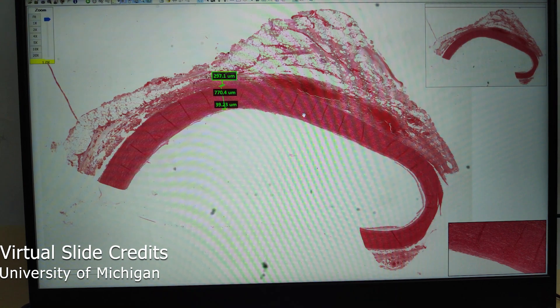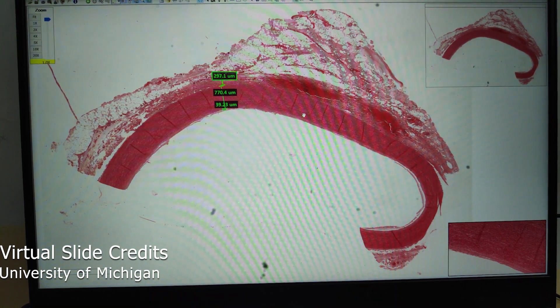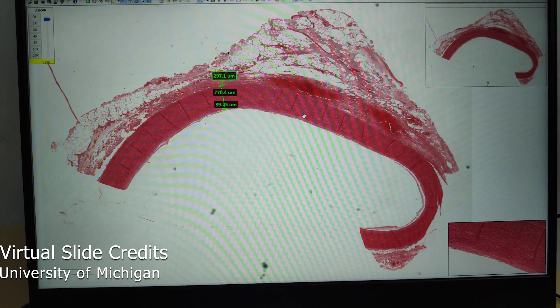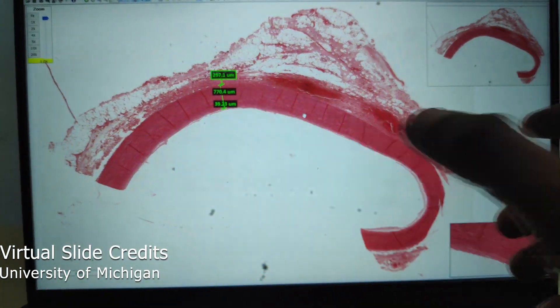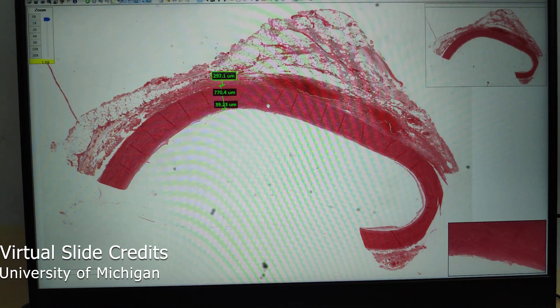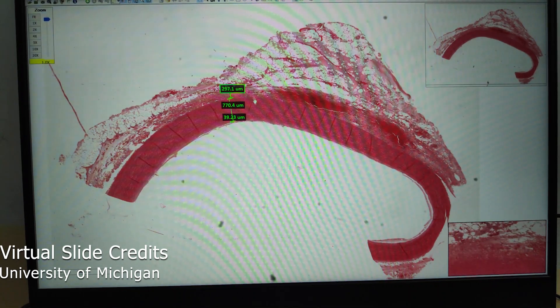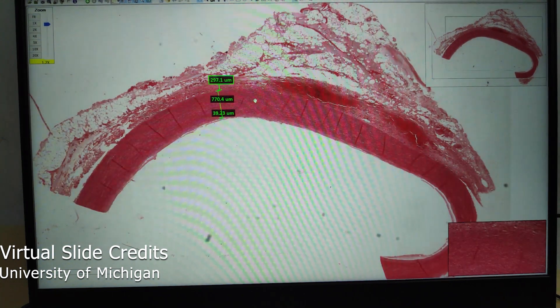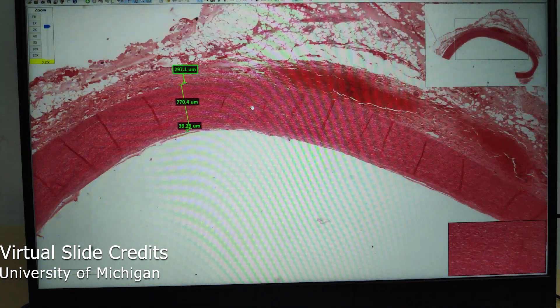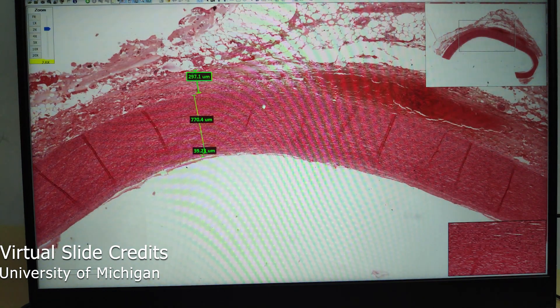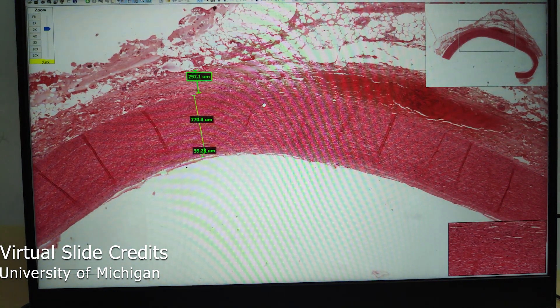This is a virtual slide of a large artery, also called an elastic artery. By large artery, we mean an artery with a caliber of more than 10 millimeters, or one centimeter. We will look into the layers, because as I mentioned initially, it is by the proportion of the layers that we can determine whether it is an artery or a vein.